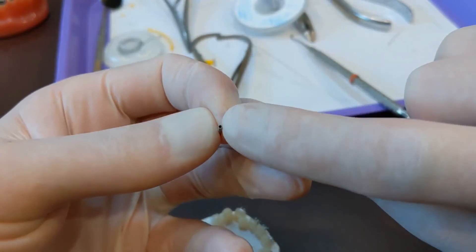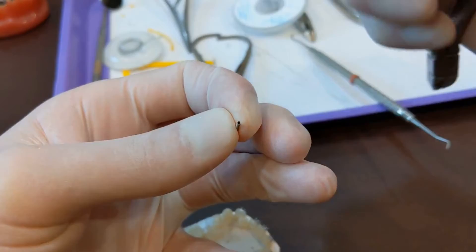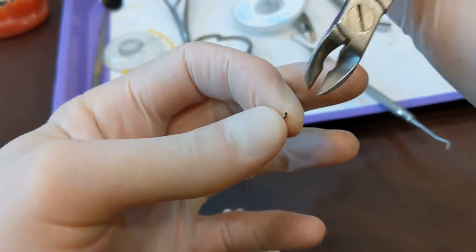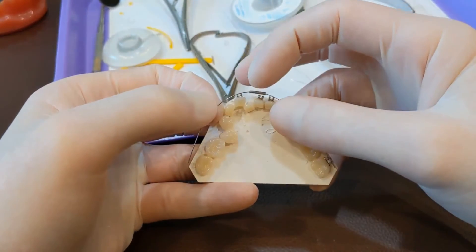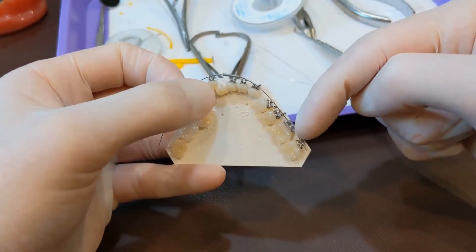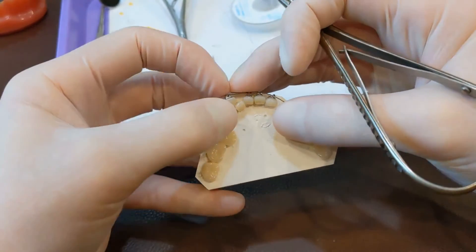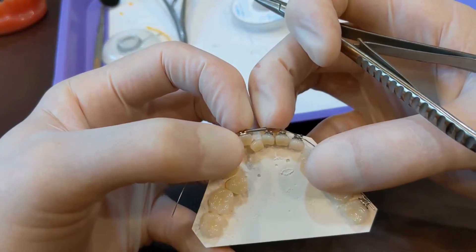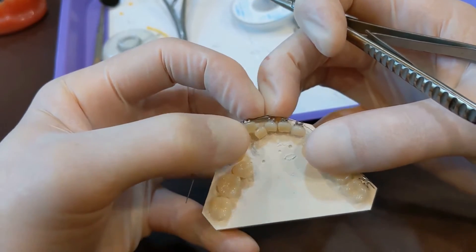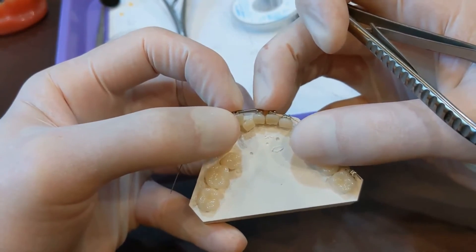Sometimes when you clip it, the little coil will bend down and close up where you need the wire to slide in. If that's the case, just reach in there and clip that extra. It didn't happen this time, but sometimes it will — so watch for that and clip any little piece that folds down. To place the closed coil, slide it onto the wire, get the wire started in the sixes and sevens, and make sure it's going to fit in between those brackets. You don't want it a little too long or you can't get it in there well.